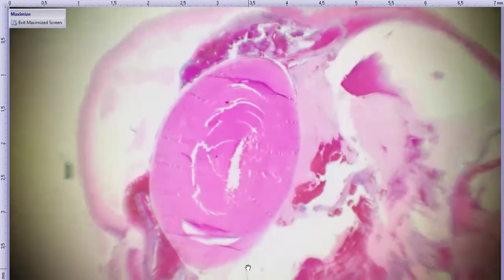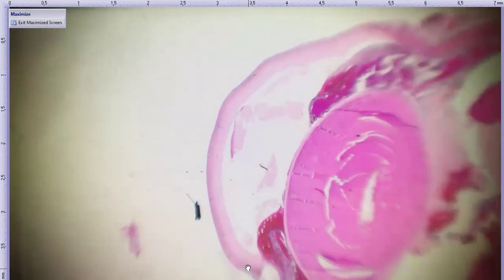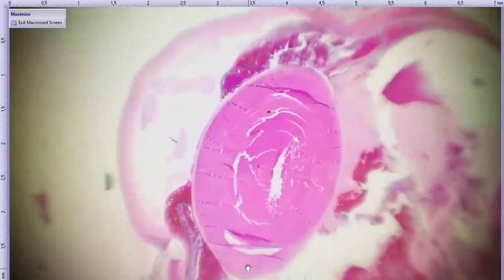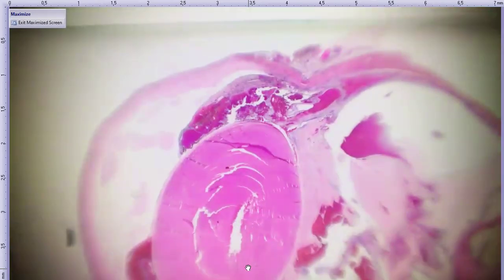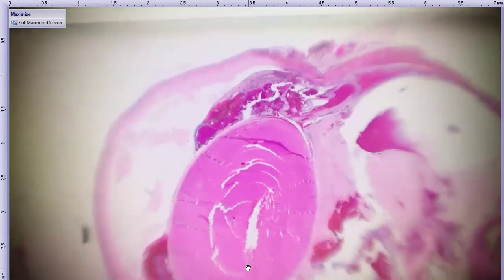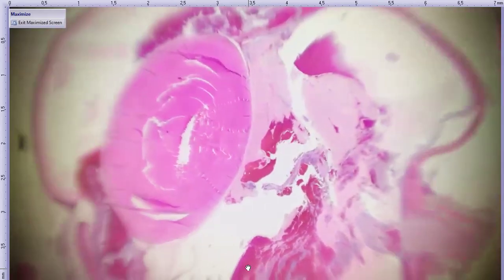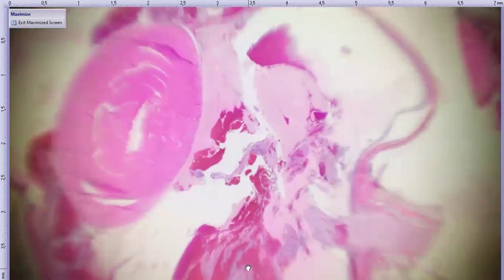All right. Subgross view. So there's the cornea. You can see that the iris leaflets are nicely adhered to the anterior lens capsule, so that is consistent with posterior synechia. And you can see that they're kind of bowed forward a little bit, so there's evidence of iris bombe as well. The lens is looking fairly normal from this magnification.